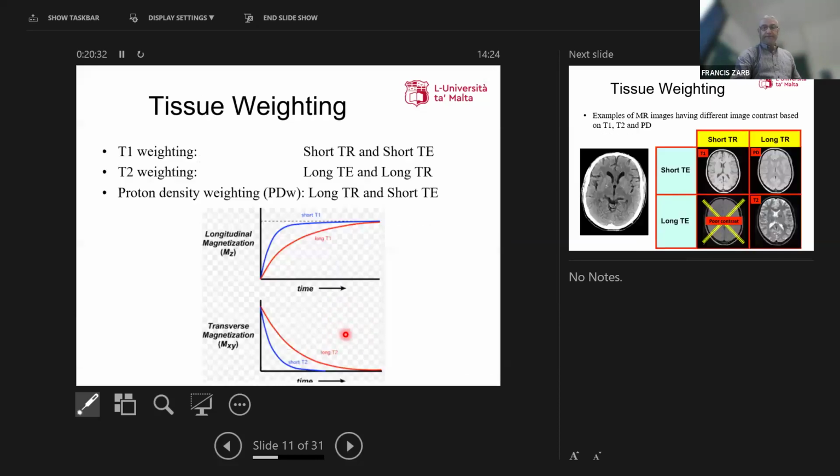So, for T1 weighted imaging, now the parameters, the balance between TR and TE. If I want a completely T1 weighted sequence, I need to enhance the difference in T1 relaxation time, but limit the T2 changes, variations.